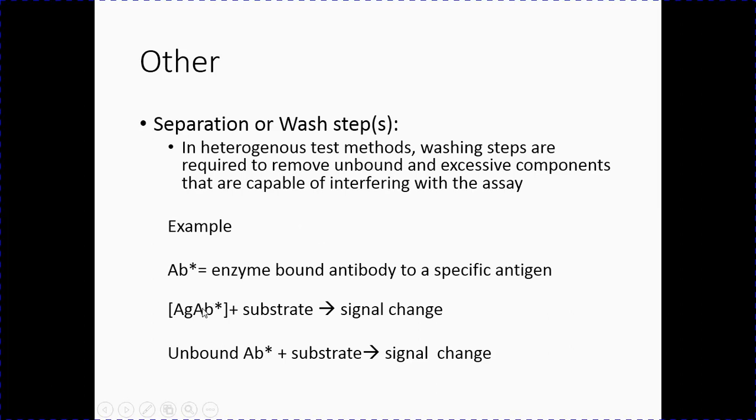And I put them into a test well together. I let them sit for a little while, and I allow complexes to form. Under normal circumstances, anytime we are forming those antigen-antibody complexes, what do we have to do? We have to rinse afterwards. But why are we rinsing?